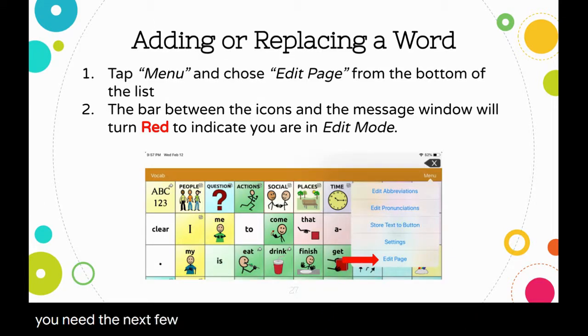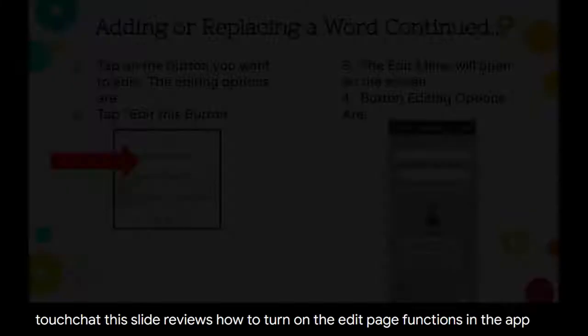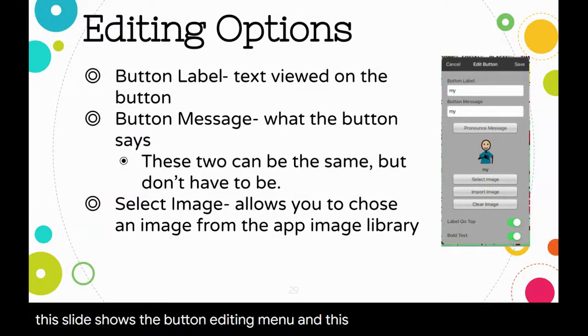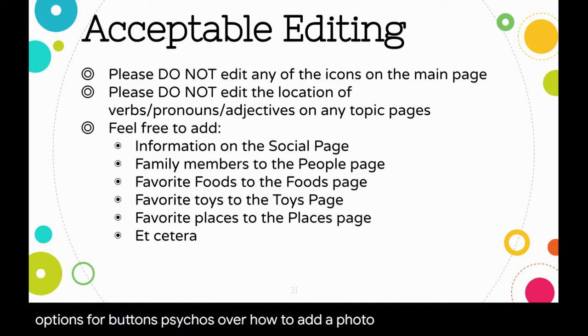The next few slides are written directions for editing a button in Touch Chat. This slide reviews how to turn on the edit page functions in the app. This slide shows the button editing menu, and this slide continues with our editing options for buttons. This slide goes over how to add a photo.